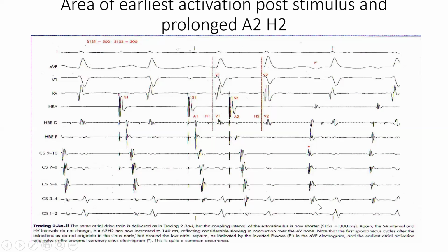Just look at where my arrow is. There is an A, H, and there is V also, where your cursor is now, which corresponds to the surface ECG.